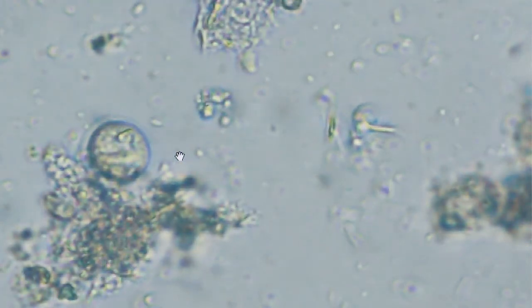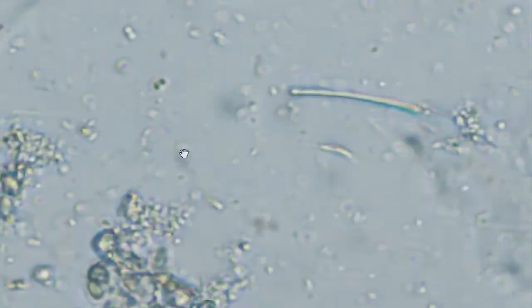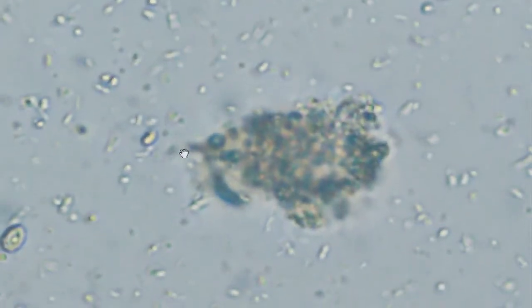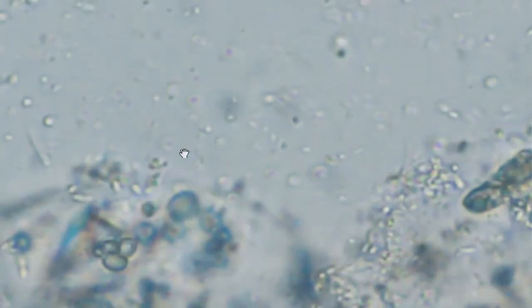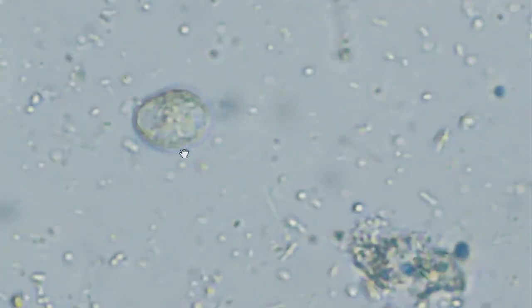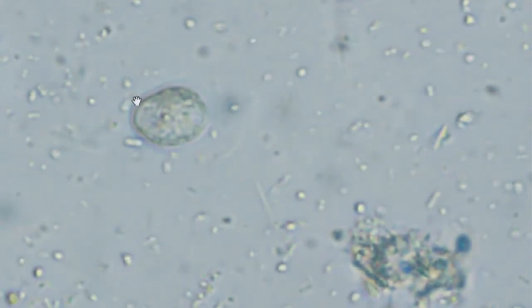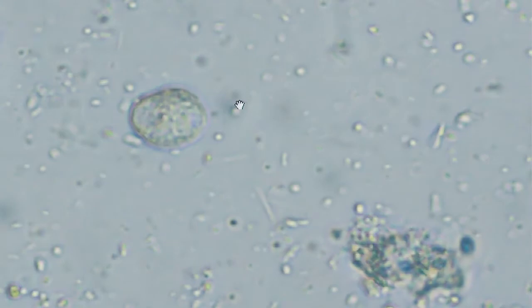in that cyst. Now, one of the things which the early parasitologists used to say was it's harder to see the nuclear morphology of Entamoeba histolytica in a wet prep than it is to see of E. coli, and I've found that as well, that when I've worked where I've only had access to wet preps, when someone had amoebic dysentery, you really often couldn't see the nuclear morphology very well, and yet with E. coli I could always see it very well. Here's another, probably trophozoite, and here's 2 vacuoles present within that trophozoite.